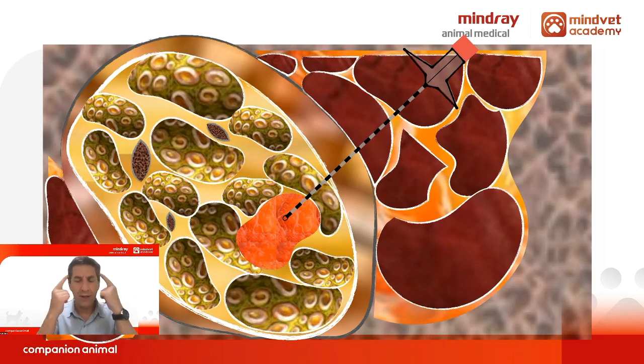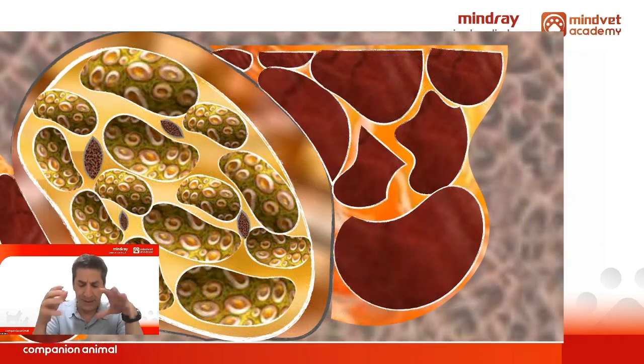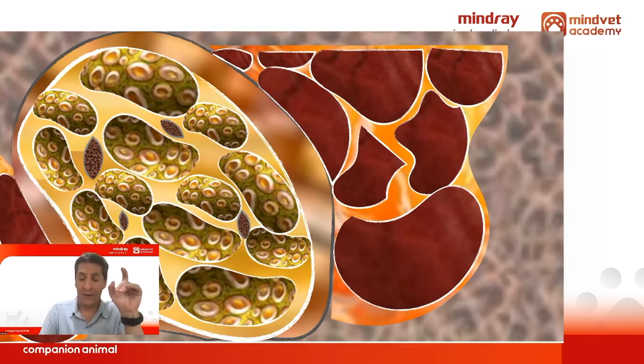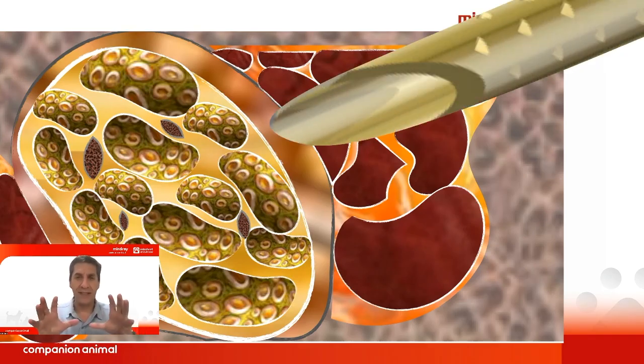It's mandatory to keep this in mind, which is super important in our setting, because the nerves we block in small animals, dogs and cats, are super small. But we use the same needle physicians use for humans. But the relationship between the needle and the nerve we use to block is the one we are seeing on the screen.